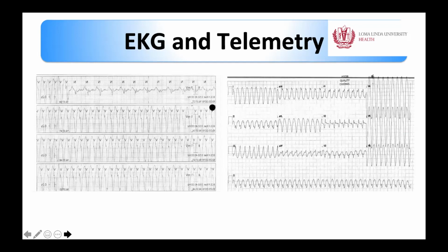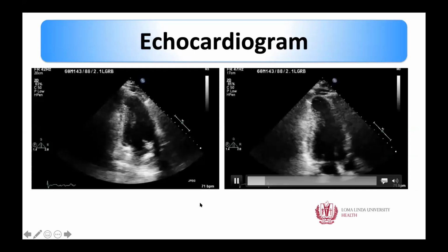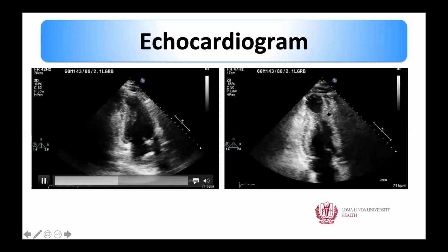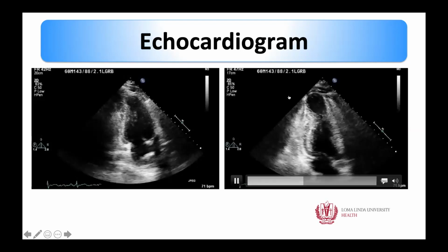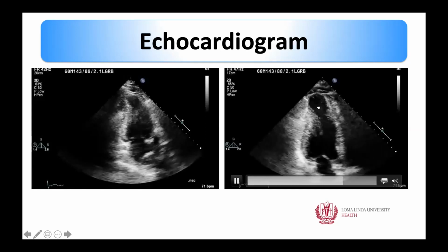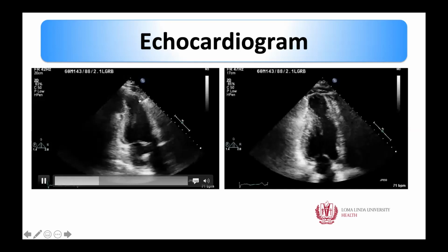He has VT, it looks like monomorphic VT. And then he gets the echo, and you can see that he has this outpouching of the apex that is happening here. So this is that mid-ventricular type that I had shown you all in the phenotypes, with mid-ventricular obstruction leading to the outpouching of the apex, or the aneurysm of the apex.